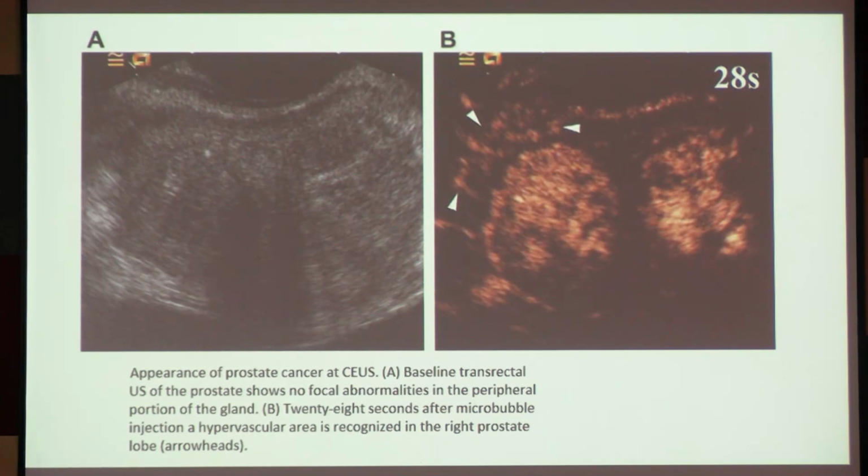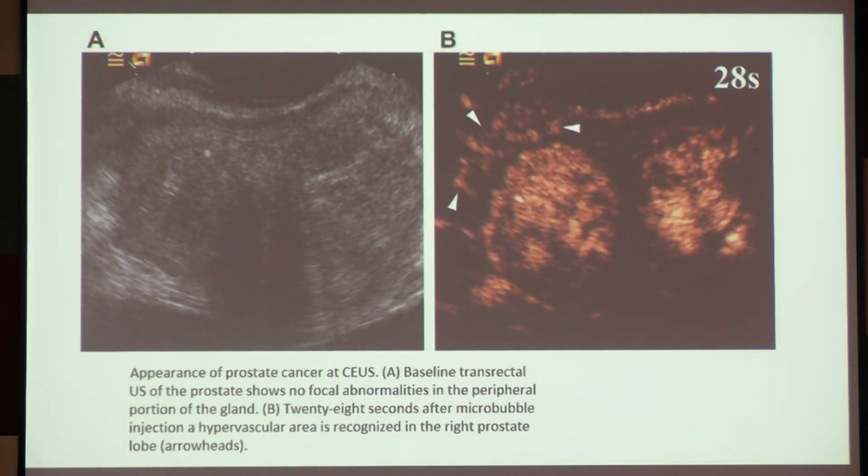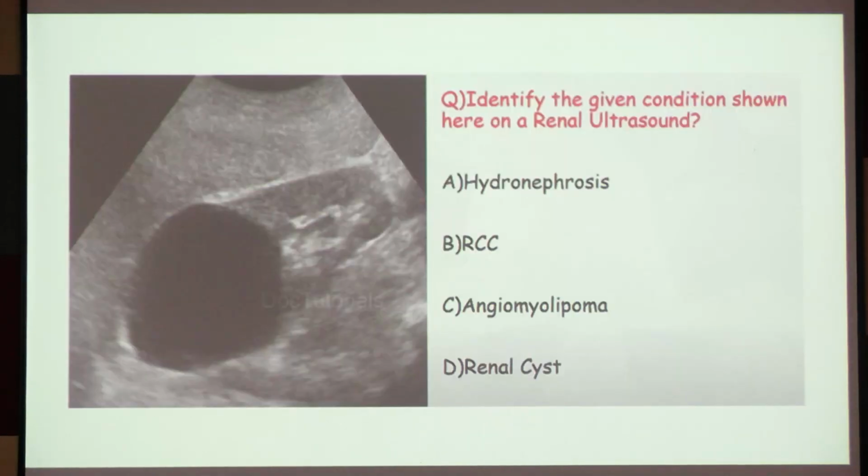So what I just want to tell you is that there is a contrast material available for ultrasound. Just remember that it is air. Which type of air? It is microbubbles of perfluorocarbon or nitrogen gas. That is the only thing you need to remember, nothing else.